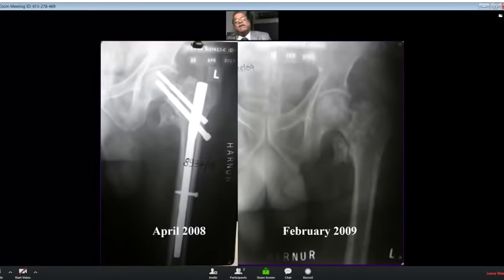If Z effect happens, I just keep the patient in traction for some time, and then once the fracture becomes gummy, I just remove the complete screw. That's what I am doing in the last 7-8 years, and even I'm advocating the same.